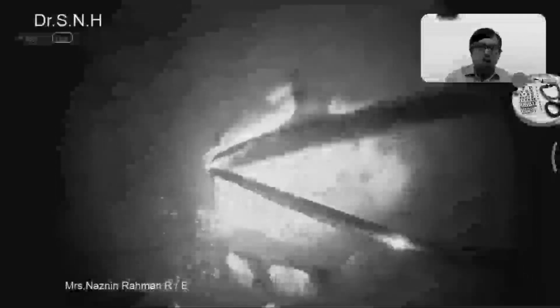It's the normal view you have in the 55 inches big screen when you do this surgery. So you can imagine the clarity of the depth. I can see the retina, I can see the vitreous, there's a PVD induction. It's much easier for me.